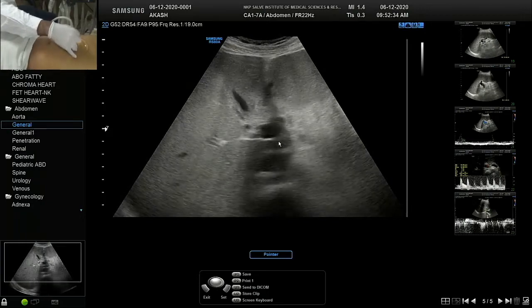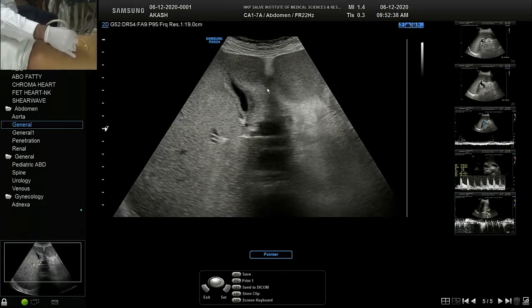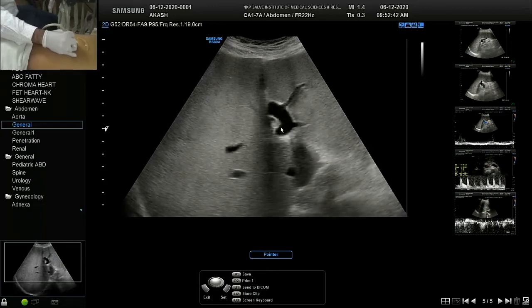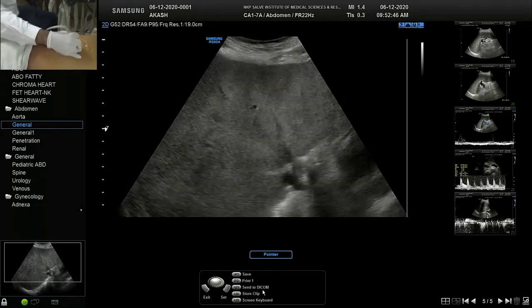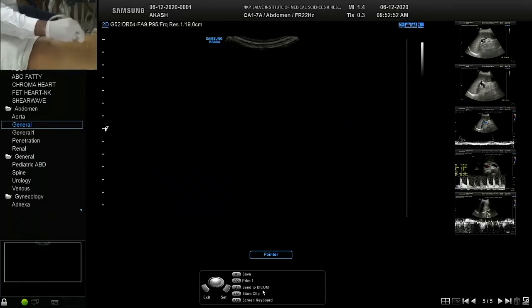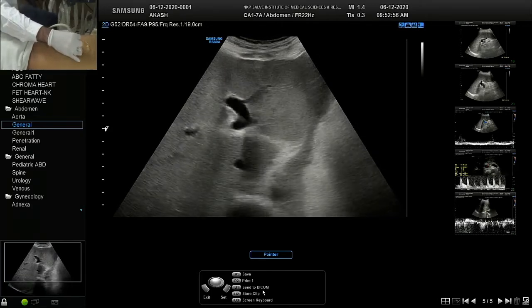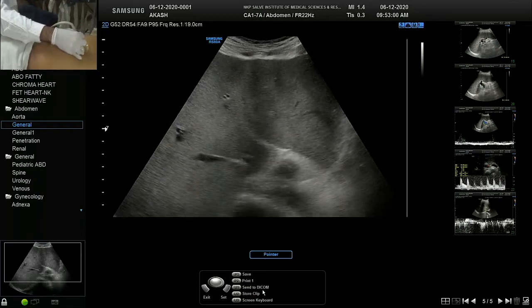Okay, and this is the ligamentum teres, and again what you see here is a small anechoic structure that is going from the left portal vein here. So similar finding as we had seen in earlier patient. So we move piece to piece now. We'll evaluate the epigastrium completely. Left lobe is enlarged. Caudate lobe is almost normal size.